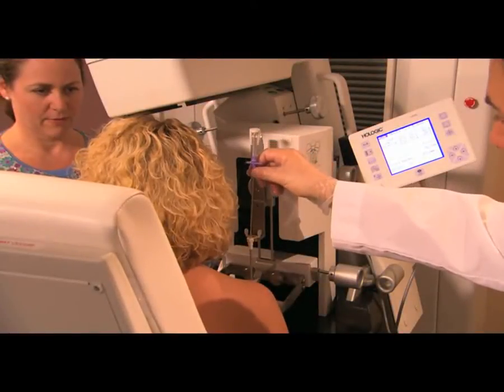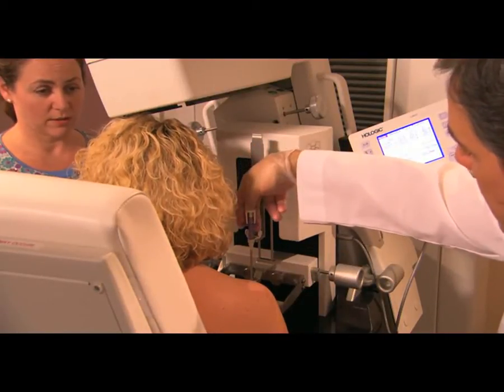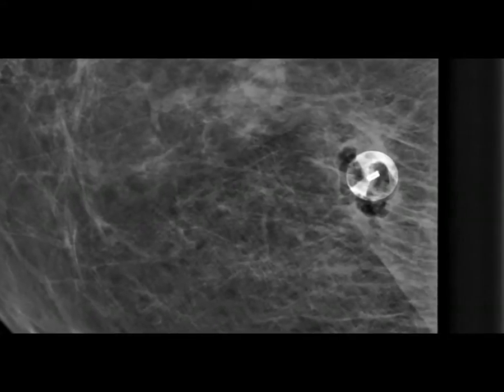Finally, a tiny marker is placed at the spot where they took the sample. This can be seen in future mammograms to show the location of this biopsy and to minimize the chance that this location would be biopsied again. They check one more set of images to make sure the marker has been placed successfully.